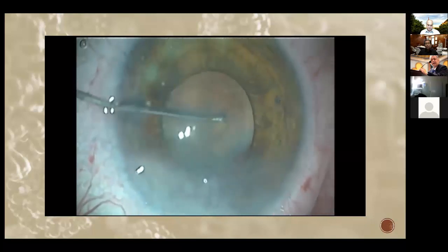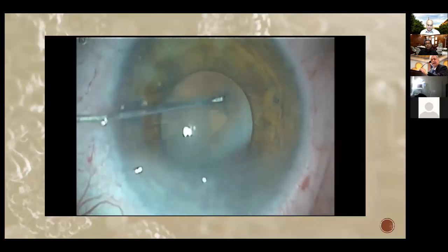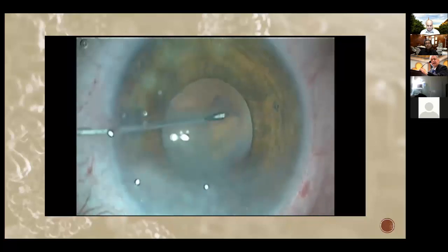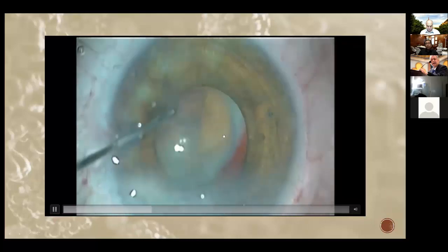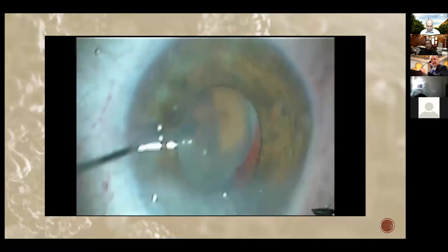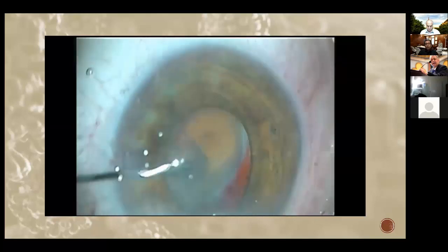How can I use my cystotome when there is no actual integrity under the anterior capsule? The lens matter is high in the center of the nucleus, low in the periphery, and the nucleus is moving with me. So this is not giving me the stability of conditions that I use with my cystotome from the side port.